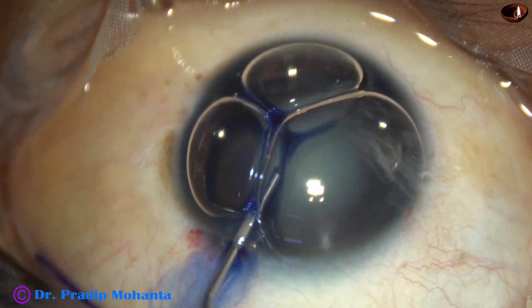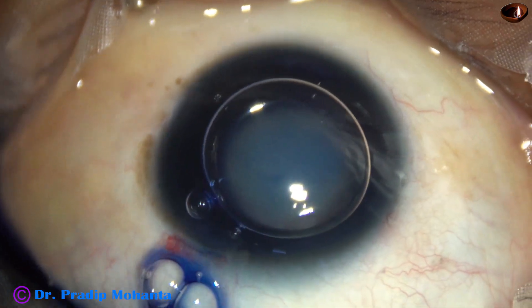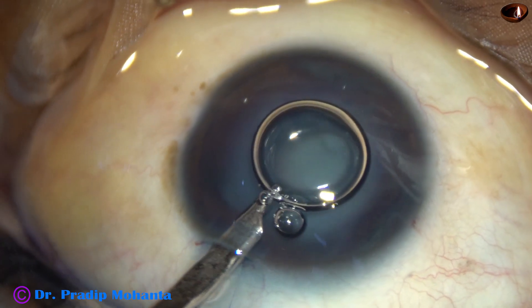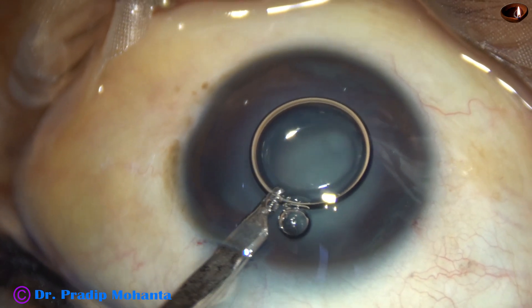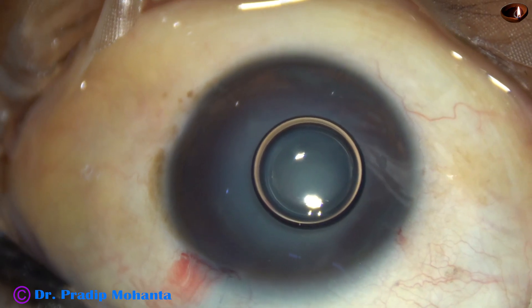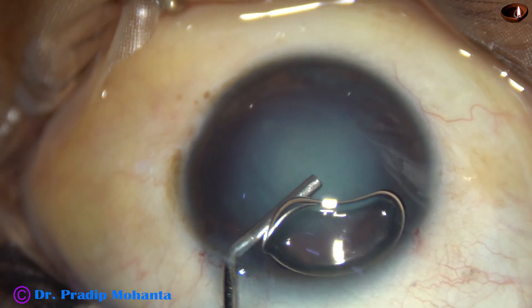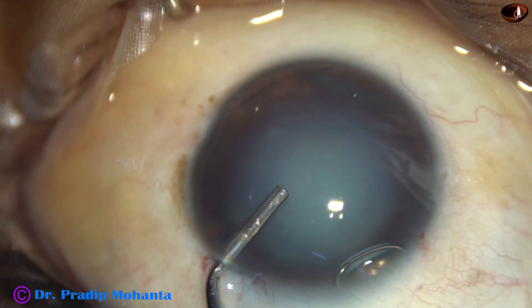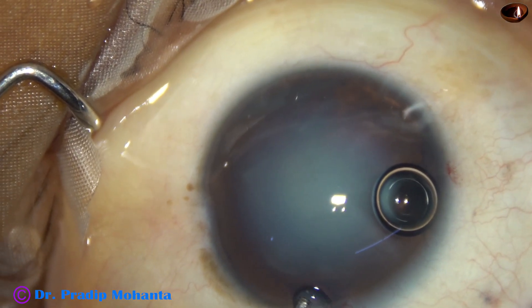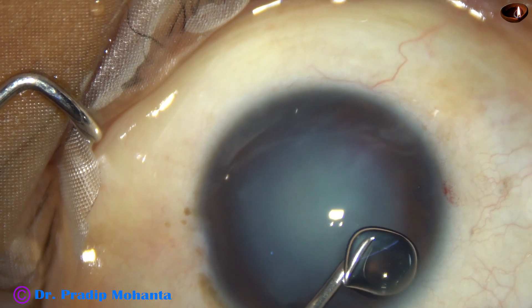And now, trypan blue dye is being applied over the anterior capsule underneath air bubbles, then the dye is washed out. And then, the anterior chamber is filled up with visco. In this case, it is 2% hydroxypropylmethylcellulose. The air bubble may cause some problems, so I inject visco again and remove the air bubble.